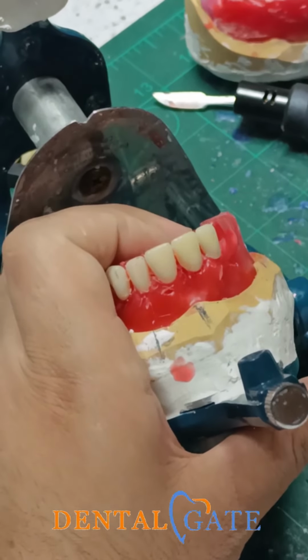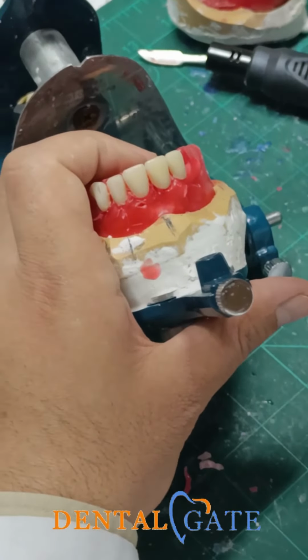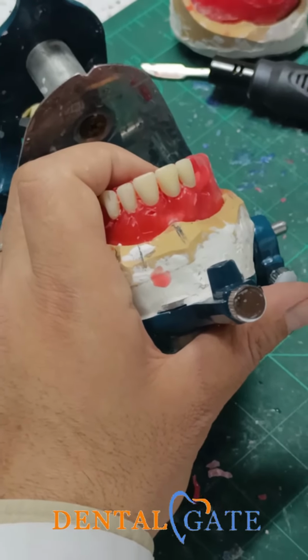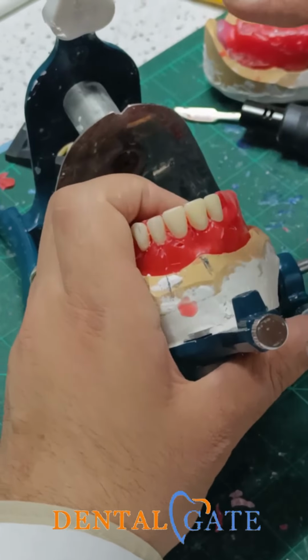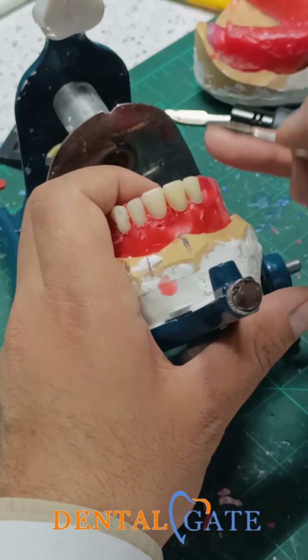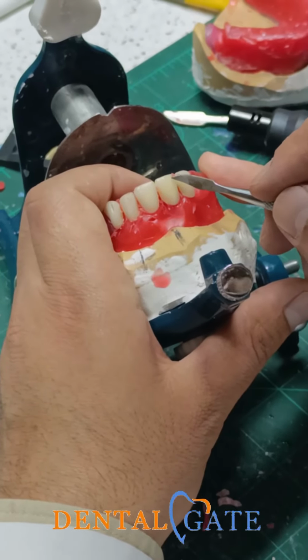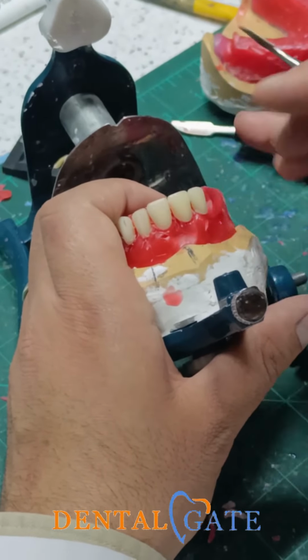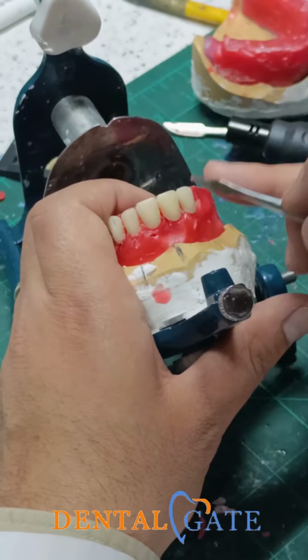It is in the junction of the middle and the... it is in what? In the incisal third but toward the cervical. In the incisal portion but toward the cervical, so you can see, according to the manufacturers of the artificial teeth, maybe you have an issue with this criteria. You can see this is the maximum coverage here. I will make a contact with the maximum coverage. This is your fundamentals. Okay? Follow these fundamentals. The maximum coverage will be located here. So the maximum coverage of the lateral should be located here.